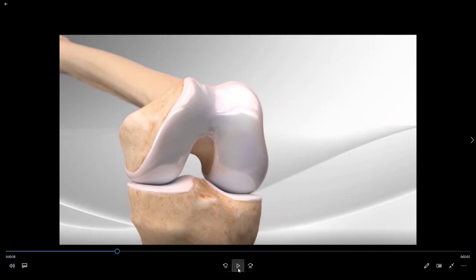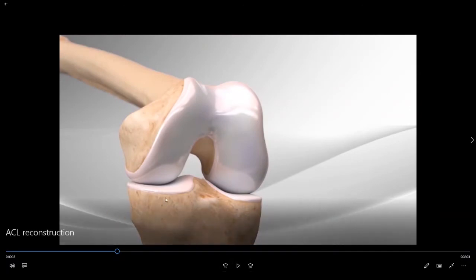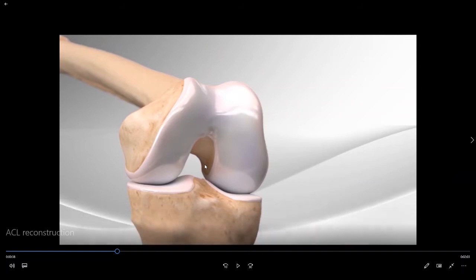Here is the left knee after the previous ACL tissue has been removed. The ACL would normally course from the inside part of the notch on the lateral or outside part of the knee, extending down to the tibia on the medial or inside part of the knee, crisscrossing from one side to the other — which is why we call it a cruciate ligament.